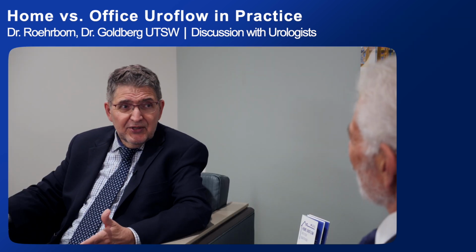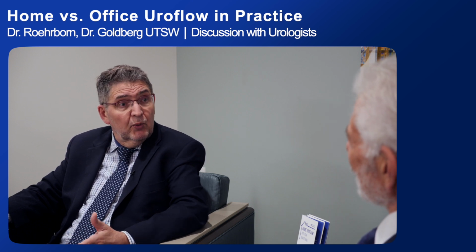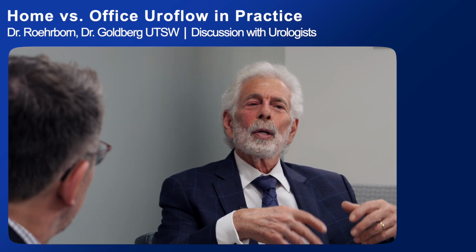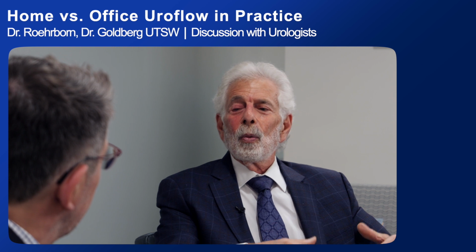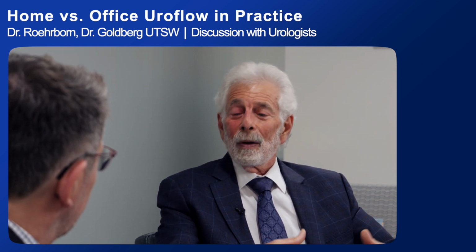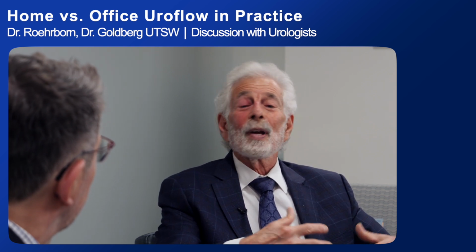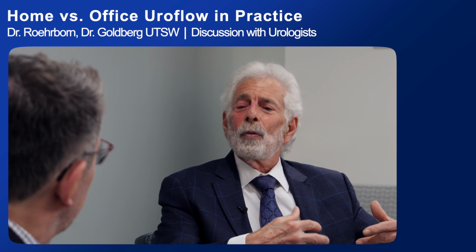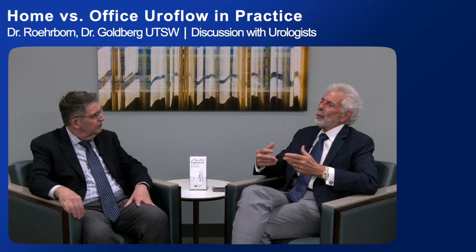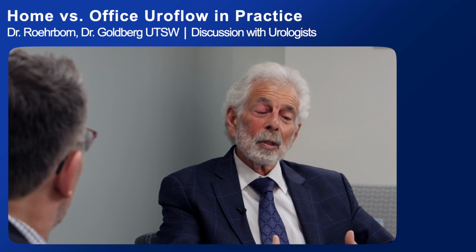So Ken, you practiced 40 years, 4 decades, a very long time. Tell me, how do you use the flow rate recording in your practice? Well, Klaus, I think flow rates are an objective way of determining what a man says when he says his flow is good or weak, or he's having issues. It's so hard to put anything to these vague types of responses. So flow rates can help you. They can make a big difference, and I have through the years relied on them. They're actually objective metrics that we can use to assess a man: improvement, deterioration, or stability.